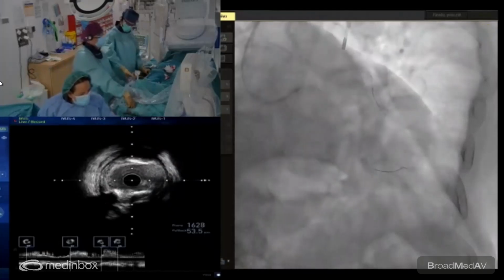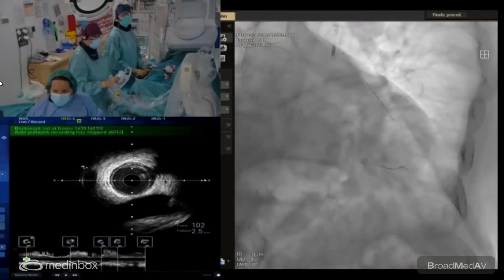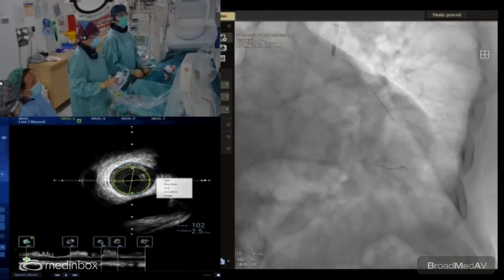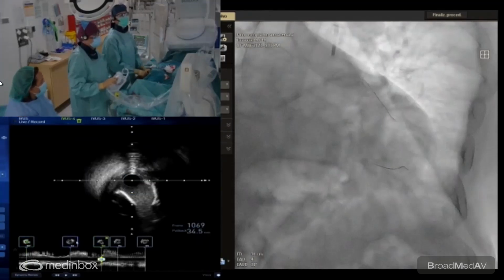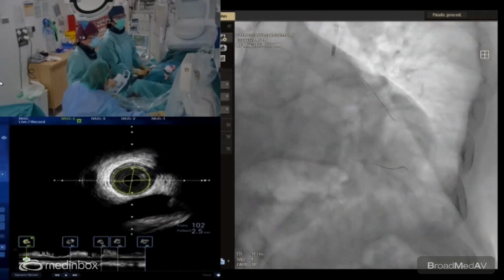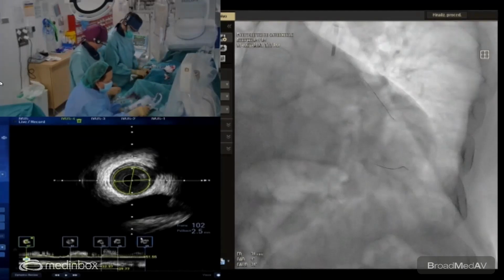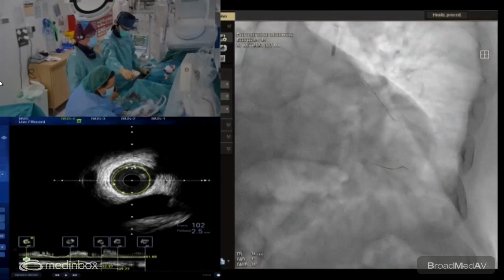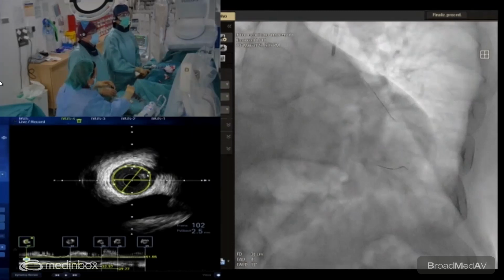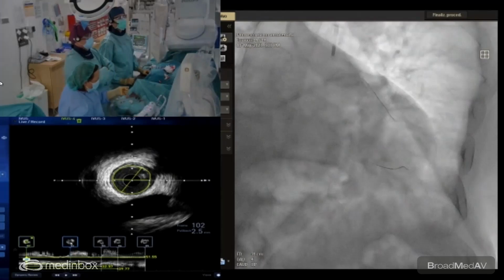Okay, we can stop here. Let's go out. Can we check it, Laura? B1 is the distal, right? The length? Es 220 es la luz. La capa media yo creo que es un poquito. 2,5 igual entra, ¿eh? Lo digo porque arriba es más. It's a very long distance. I don't know if we have to cover everything.